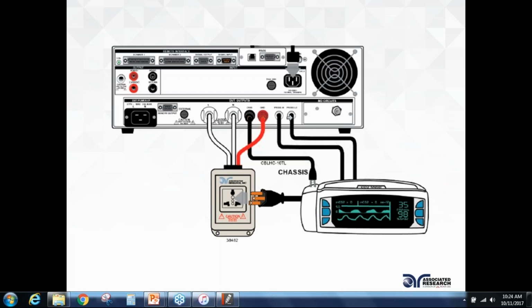You do have to turn the device on to the normal operating conditions. So if you have a heater, for instance, that needs to heat up to a certain level, then you want to run your medical device for the first 60 seconds to get it up to a normal operating temperature and normal operating conditions.